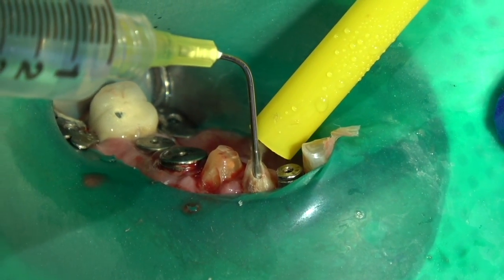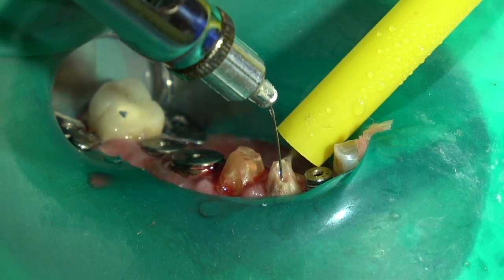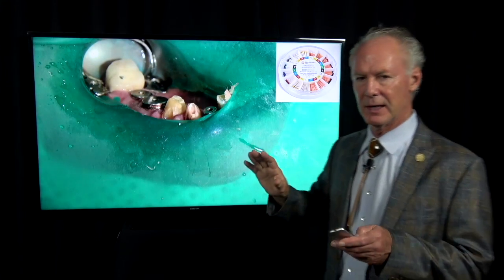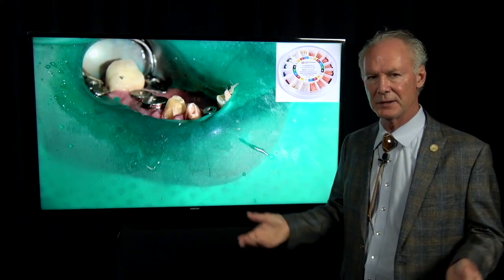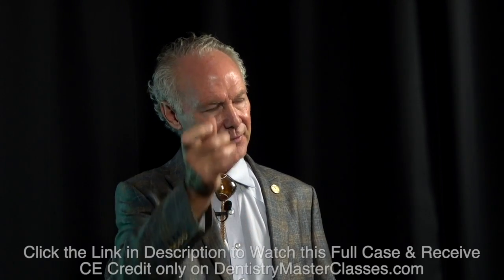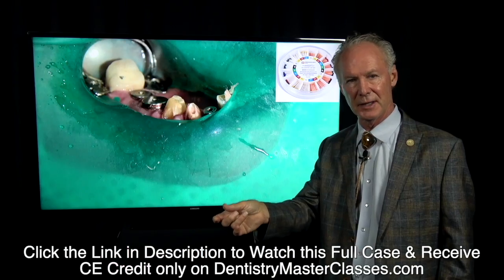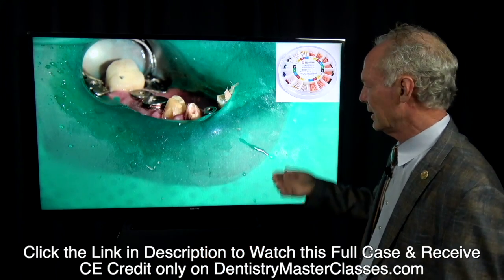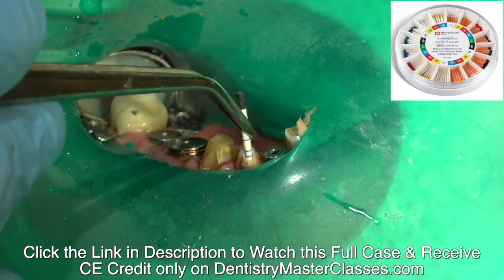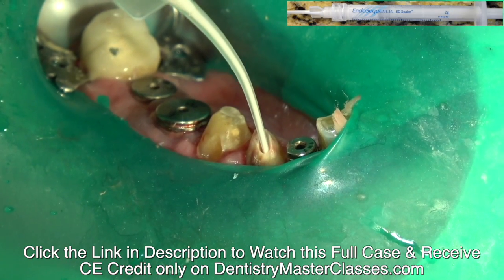I'm going to irrigate once again without pressure — just very lightly in the canal. Then I'm irrigating with a 30 gauge needle and local anesthetic. There's nothing magic about the local anesthetic — the 30 gauge needle fits perfectly in that open canal and it just happens to come with the local anesthetic. You're using it to rinse out the dilute sodium hypochlorite and any other debris in the canal. Then blow some air in there very gently and come back with paper points to dry it.